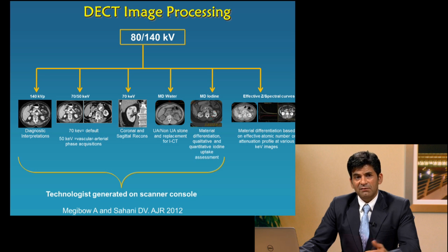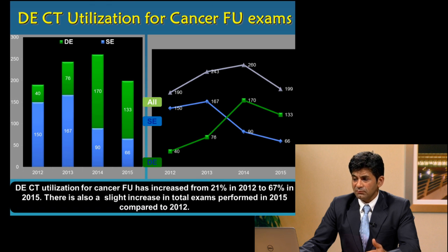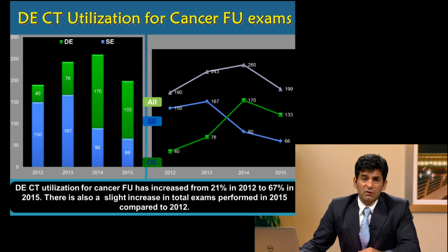And occasionally we have to go to the workstation for advanced post-processing. Now, despite the challenges I mentioned, because of the clinical offerings and various benefits that I mentioned, the utilization of dual energy CT in our practice continues to grow.